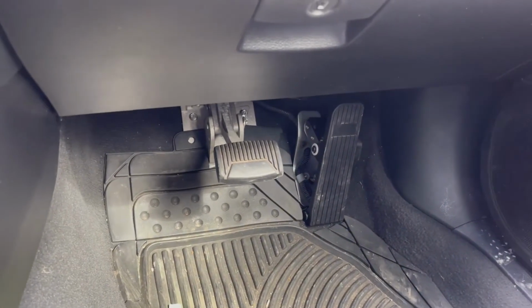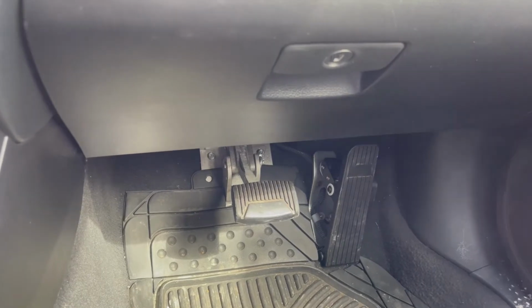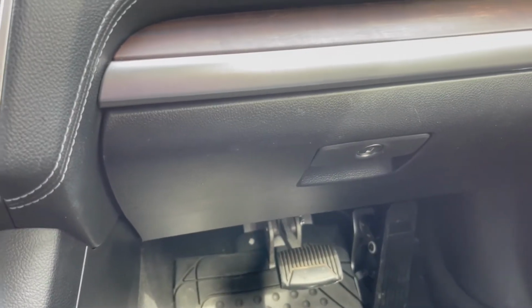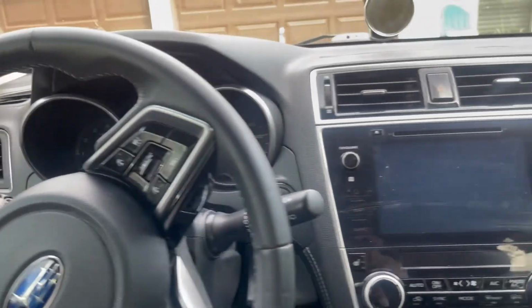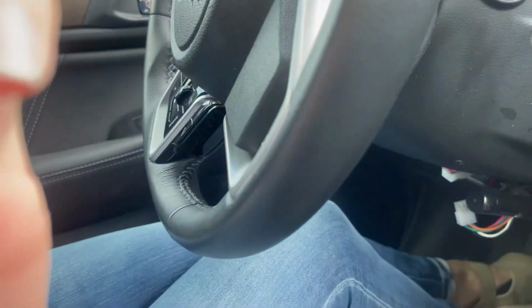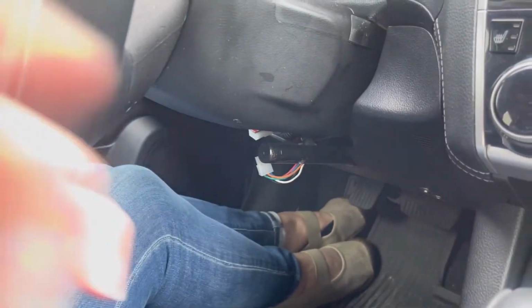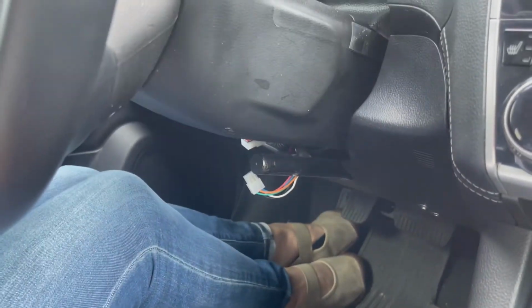Down here is my instructor brake and gas pedal, and I can put the gas pedal on or not. As far as otherwise, the vehicle is set up pretty normally. Underneath there is a special attachment right here, and you can see the electronics hanging down where we put our hand controls.